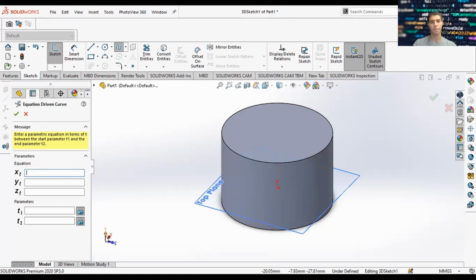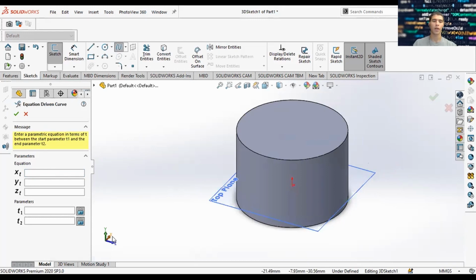And so for our equation-driven curve, we have our y, x, and z. Let's type in the function to find this shape, the shape for this scallop cuff. So what do these functions mean?